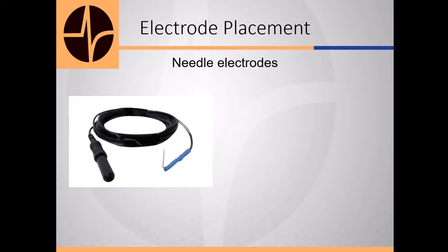And I see people take the straight electrodes and bend them themselves and use them. The problem with that is that if that needle breaks and it breaks off in the patient's scalp, whoever bent it and placed it is going to be responsible. That's their liability. If they use ones that come from the manufacturer with this bend in them, then the manufacturer will be liable. And these aren't straight needles that they've bent. These are actually molded that way. So they have a 90-degree bend or a 30-degree bend or even a 45-degree bend.